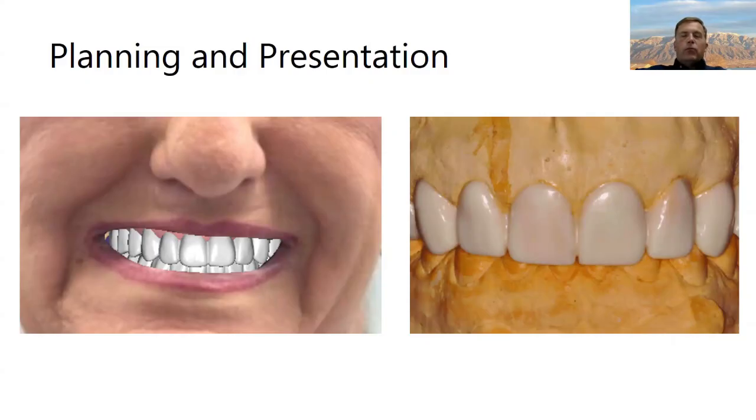And there's a variety of different ways we can both evaluate this and present it to patients. With facial scanning or even with a 2D photo, a lot of times we can align our design to the person's facial photos and show them, and look at it ourselves, how it will look in their mouth. 3D scanning is more reliable because then the design and the face are scaled 1-to-1. The results on that, I've seen 4 cases, and they were right on. Every time was exactly the same as what we planned. So if you're looking to add a little bit of aesthetic predictability to your practice, maybe facial scanning is something to think about.